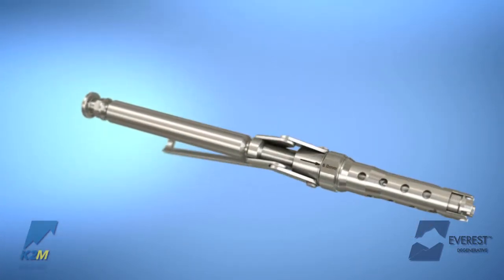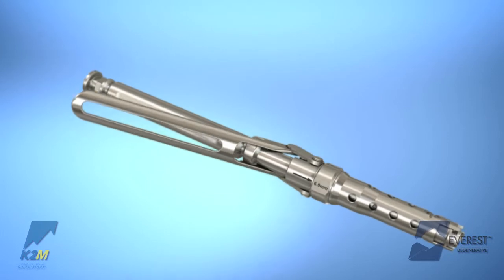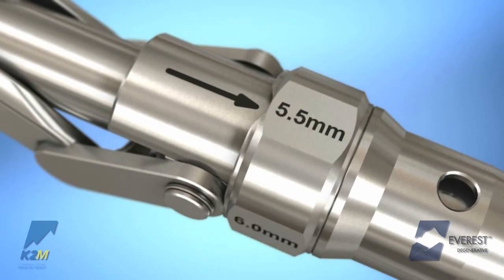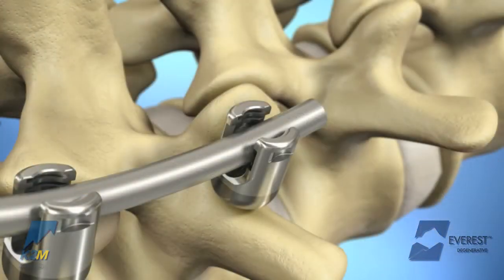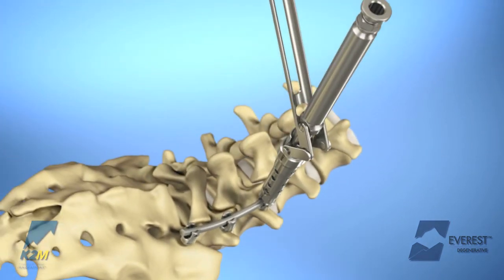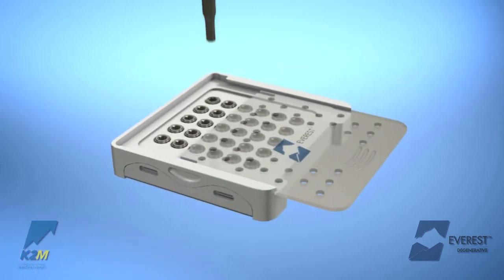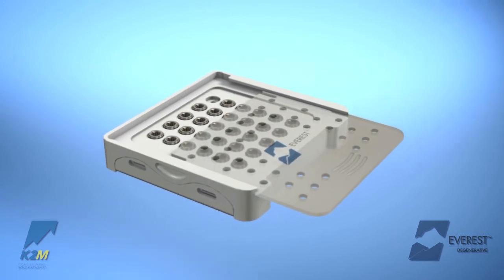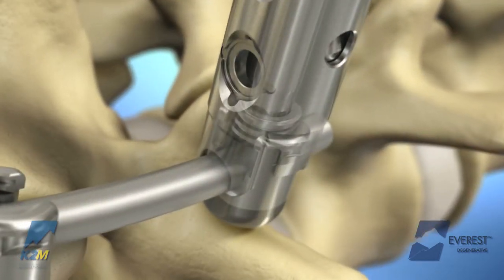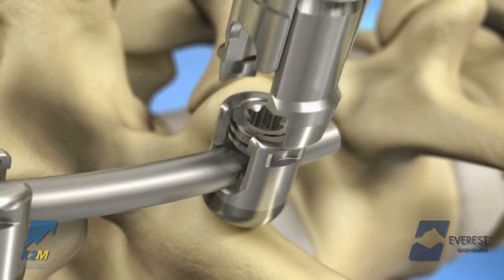The single action anti-torque rod reducer, or cicada, can be utilized for common reductions up to 15 mm into Everest implants. Adjust the knurled ring on the instrument to accommodate the proper rod diameter. Once the instrument is engaged by grasping the feet around the screw head, squeeze the silver lever to reduce the rod into the implant housing. The set screw may be passed through the center of the cicada using the long provisional driver and threaded into the implant housing. Open the silver lever fully to disengage the feet from the head of the implant and pull upward.